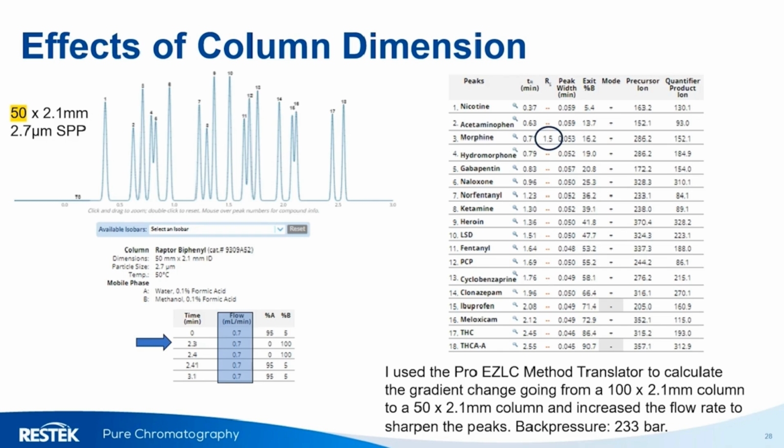Overall, it's pretty good. I have adequate resolution between my isobars, a little bit of coelution coming in between a couple of pairs of peaks there, but generally not a bad separation. Definitely workable.